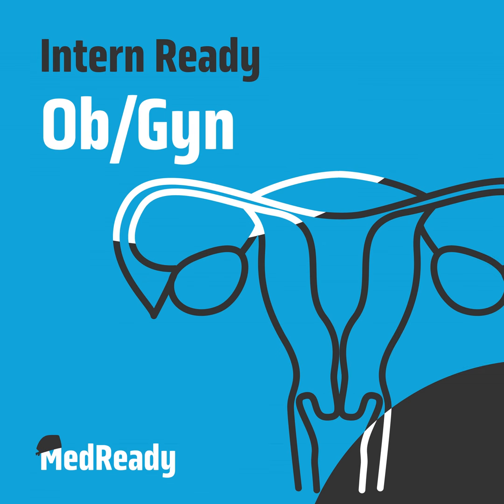Great. All right. So let's move on to what kind of fluid we typically use. Most commonly, just like Mahima said, we're using normal saline, but there are situations where we may use different types of fluid, so we can review some of those. Yeah. So for distension with a hysteroscope, we're essentially using some kind of media, similar to using air to inflate the abdomen in laparoscopic surgery. We want some kind of medium that allows the uterus to inflate from inside.